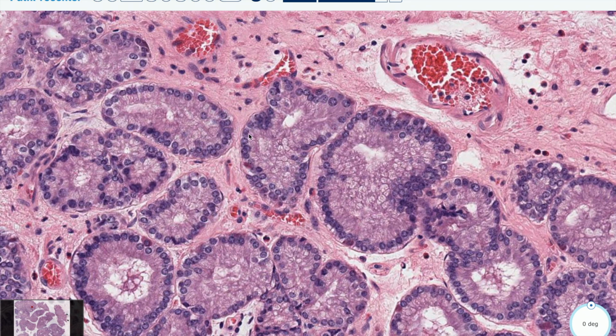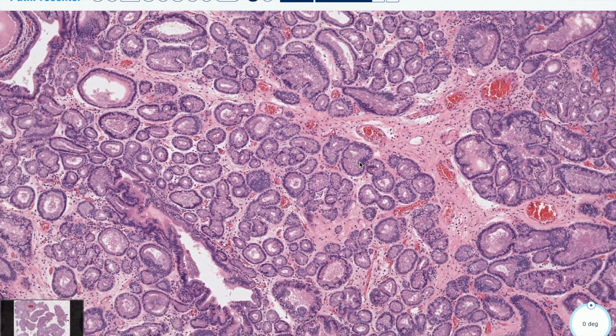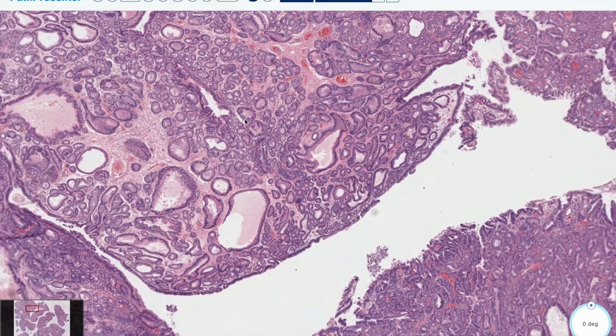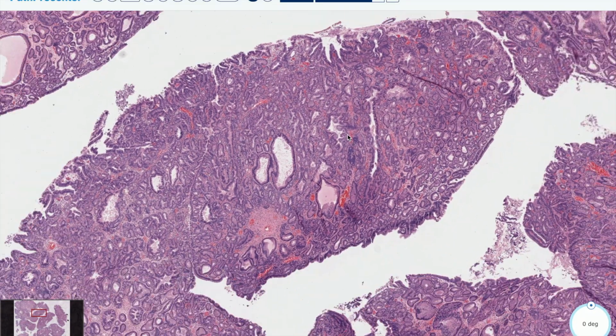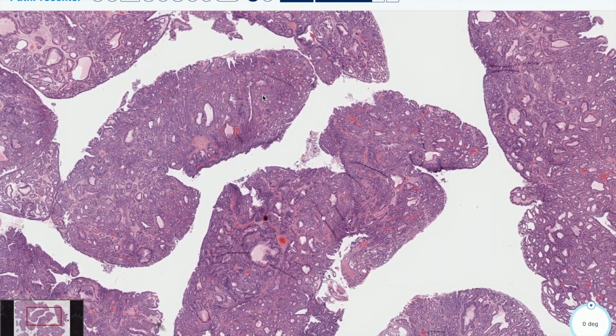like your typical adenoma that you would imagine, like a tubular adenoma that has those pencillate or elongated pseudostratified nuclei. These look a little bit more well behaved. So this entity is actually a pyloric gland adenoma, and a good one to keep on your differential.